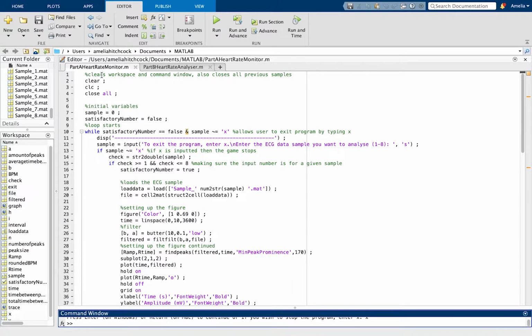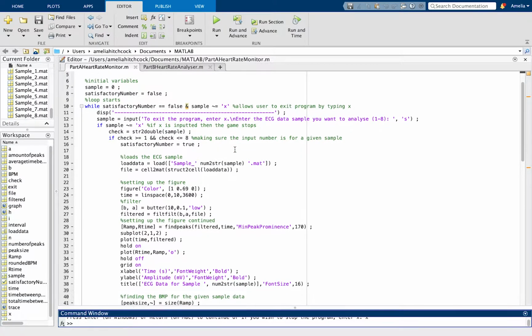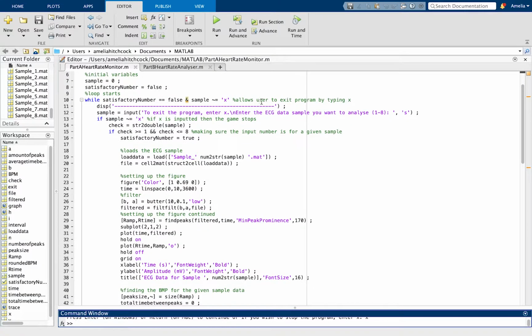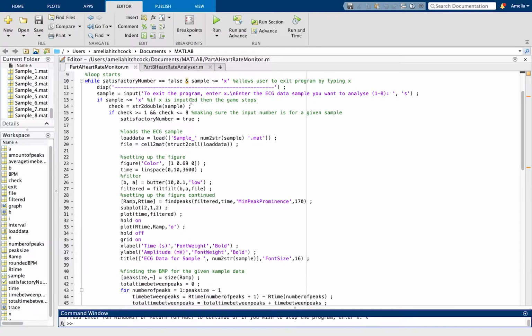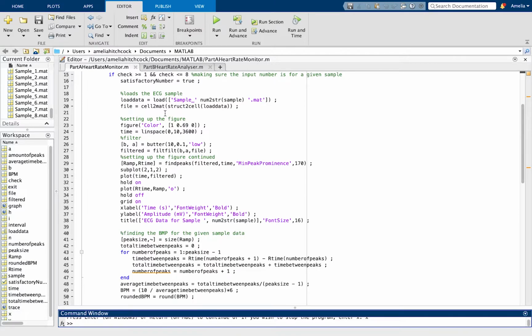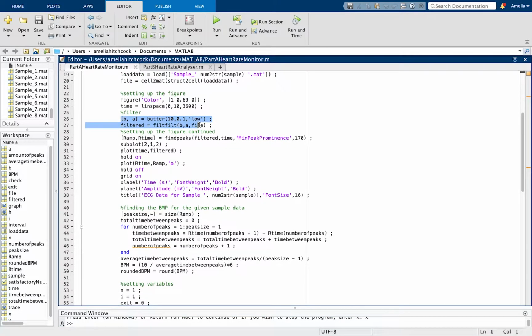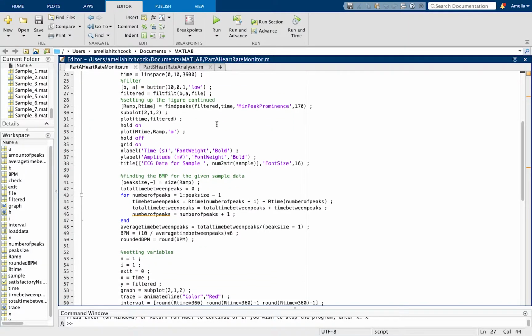So first of all, it clears everything. Then I give it some initial variables so they work inside the loop. It asks if you want to exit initially. Then it makes sure that you've done it between 1 and 8. It loads the sample you said. It sets up the figure. This is my filter. I just made a filter so it looked nicer.